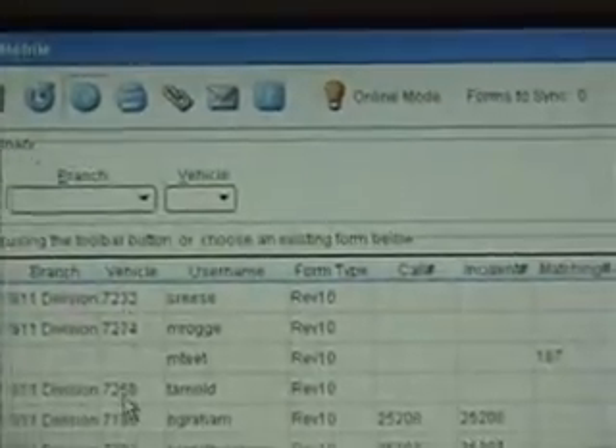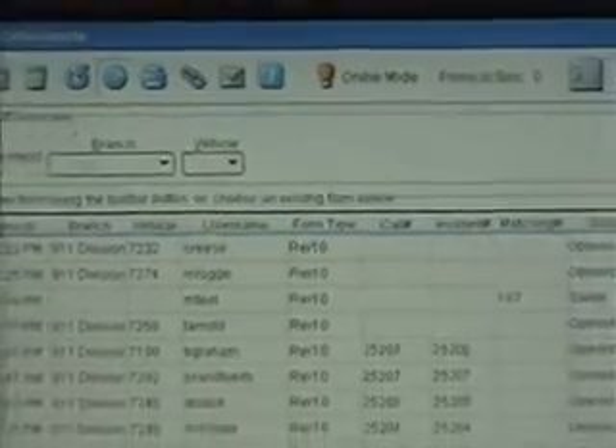All right. We can wait just a minute or we can hit refresh. There's all our 12-lead files done here. That's as far as getting it to the Toughbook — it's over here now. Now we have to marry it, or match it, to a PCR.